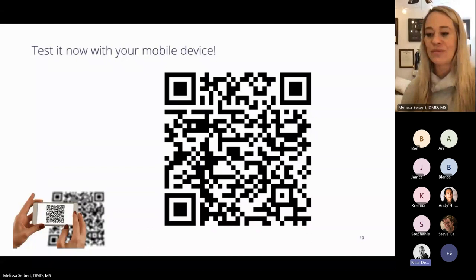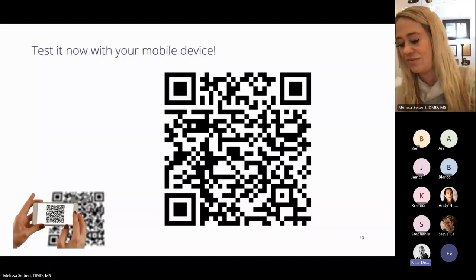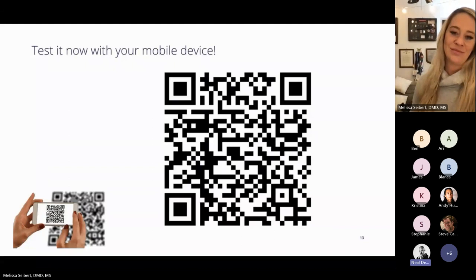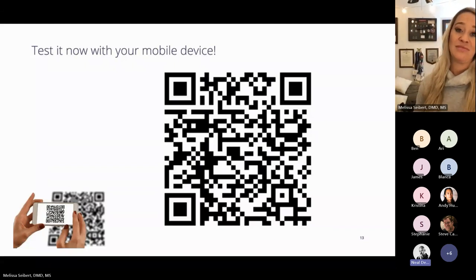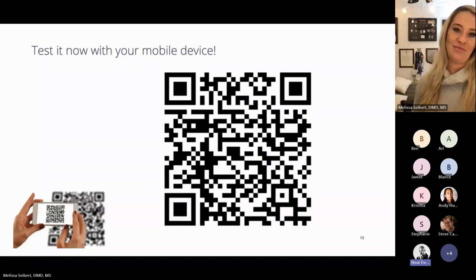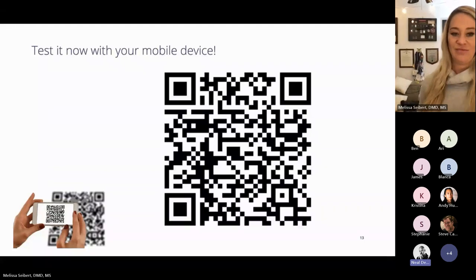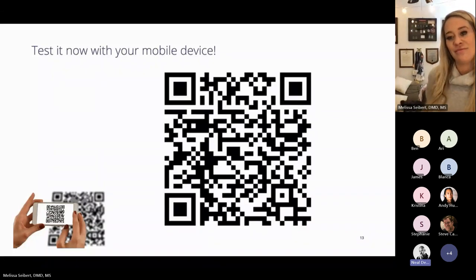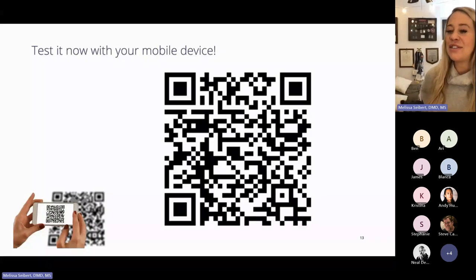Props for highlighting WebView — it's one of my favorite functions of ExoCAD. Most people aren't aware of it, but it's great because you don't need ExoCAD at all. You can send it to literally anybody. You can view it on your mobile device or your computer — no special software needed at all. You can add and remove different features or meshes, rotate it around, and look at it from whatever angle you like. I think it's a super great tool.